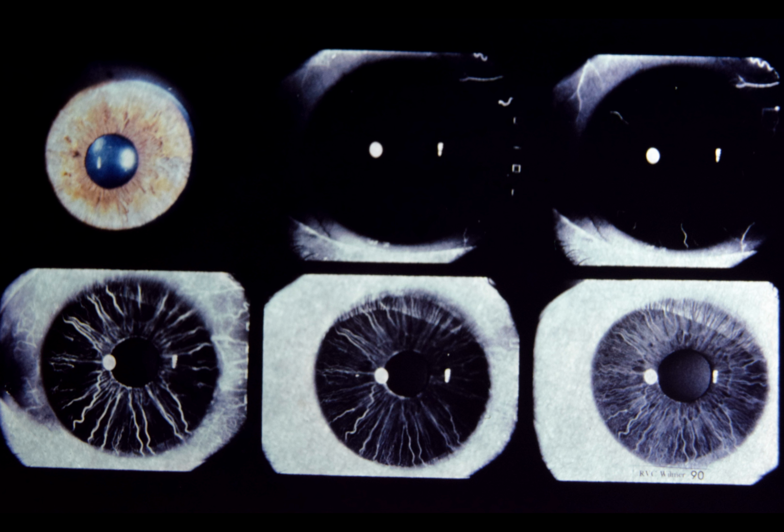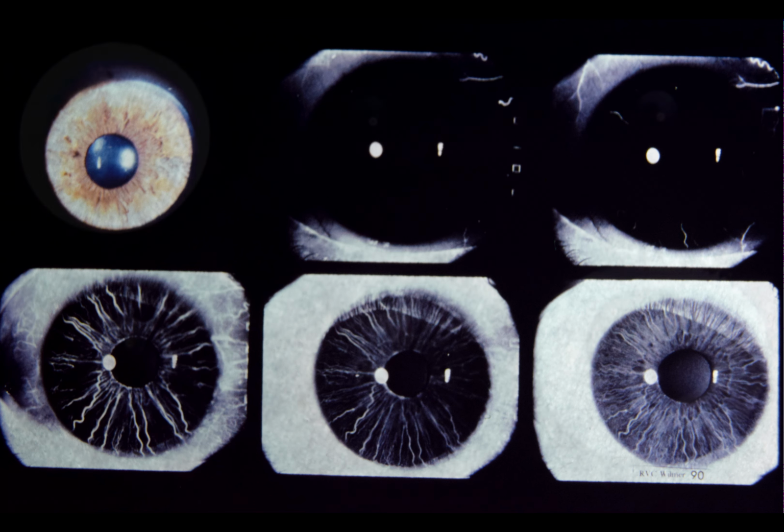Upper center, 16 seconds after dye injection, note filling of conjunctival vessels with no visible dye in iris vessels. Upper right at 18 seconds, note early filling of iris vessels. Lower left at 28 seconds, note complete filling of iris vessels with no leakage into iris stroma. Lower center, 1 minute after injection, most iris vessels remain filled with no evidence of leakage. Lower right, 10 minutes after injection, many iris vessels are still visible, but no dye leakage is present.